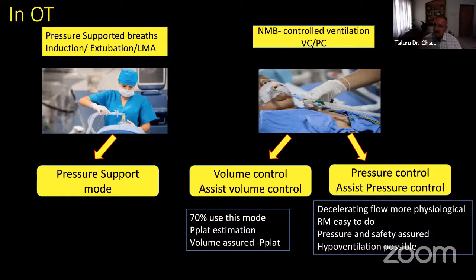Pressure and safety are assured, but hypoventilation occurs because you set the pressure. I will explain it in the next 1 or 2 slides. That is very easy to understand.